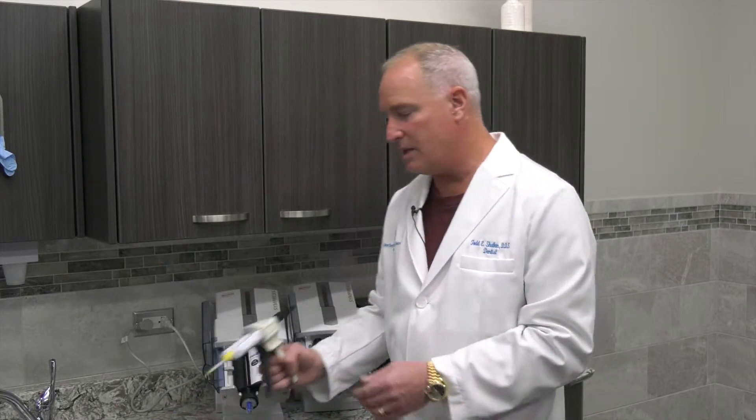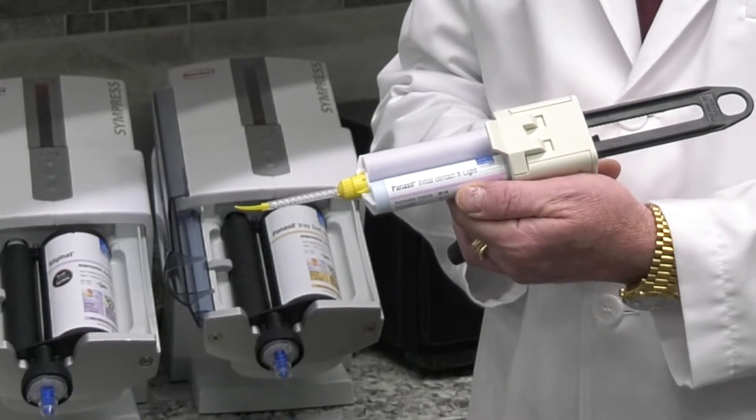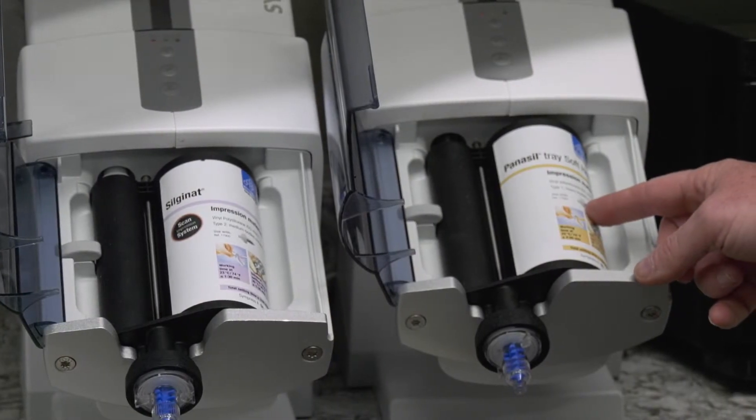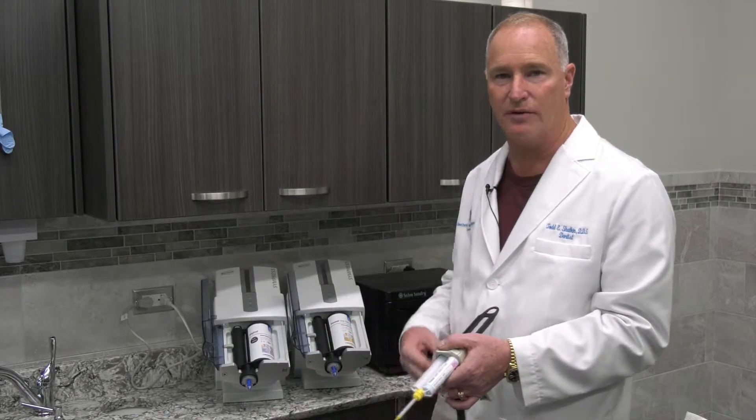It takes a fantastic impression pretty much every time. We use the Panacil impression wash material along with the Panacil heavy body material for our final restoration impressions for crown and bridge, as well as our first impressions.